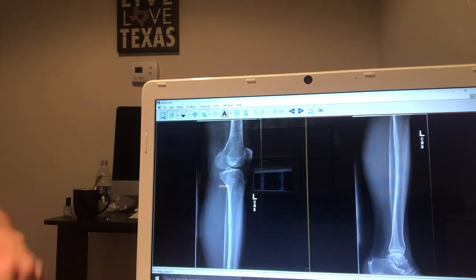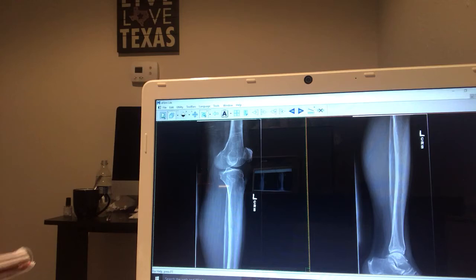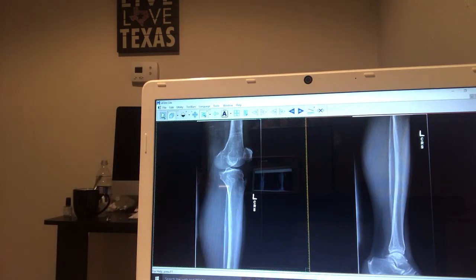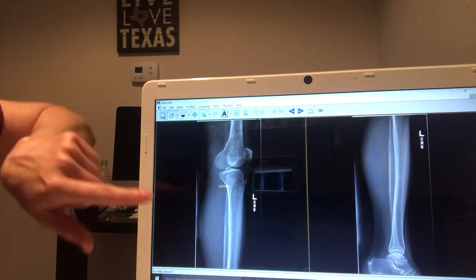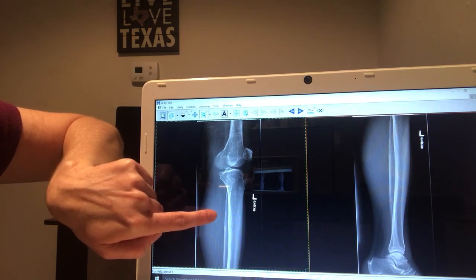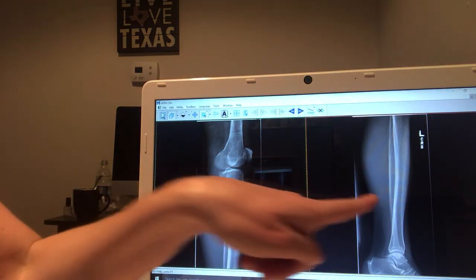The fibular head is not supposed to be more than half superimposed, and as you can see, the entire fibular head is superimposed. The fibular midshaft is not demonstrated free of tibial superimposition. You can see it almost completely covers the tibia here, or the fibula, excuse me. And it's the same on this image.